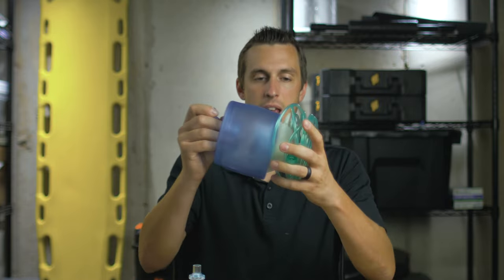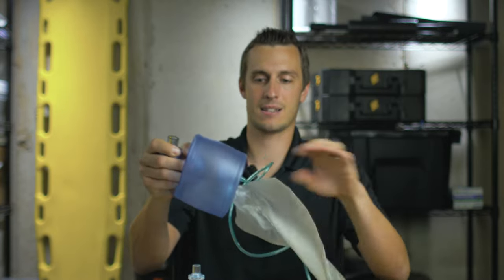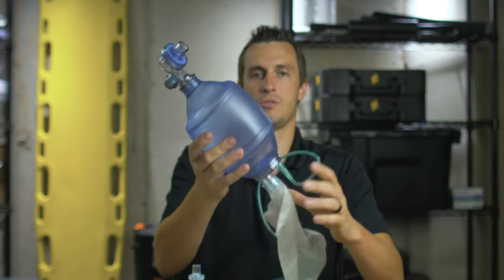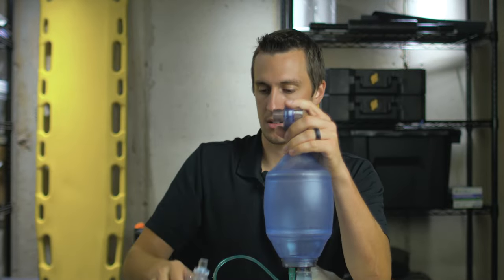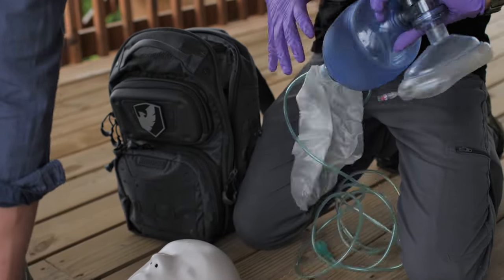When you pull the BVM out of the bag you'll have a face mask. Then you take this oxygen tubing out of the end here. There's an oxygen reservoir bag on the back side as well, and then we simply pull this apart to reveal the full BVM. Take the mask and hook it up to the end here — slide it right into place — and now our BVM is set up and ready to use.